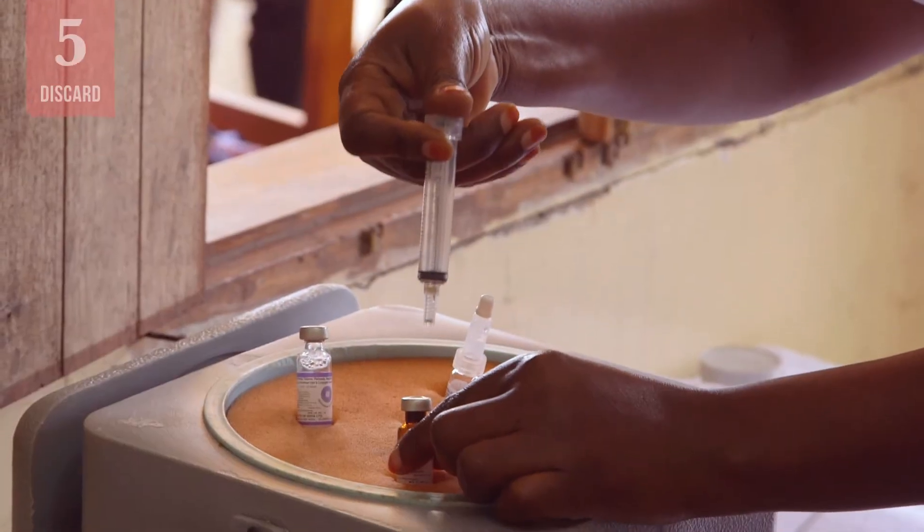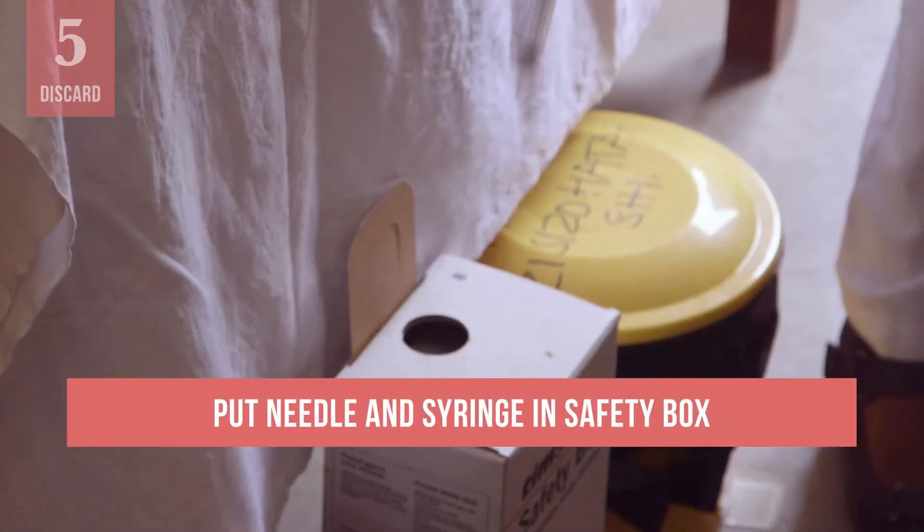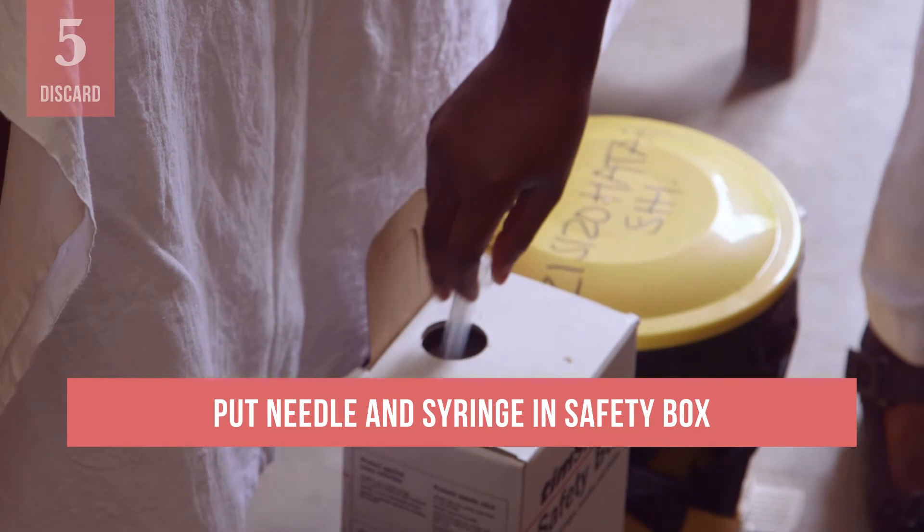Do not recap the needle after use. Dispose of the needle and syringe in a safety box, which is a leak-proof, puncture-resistant container for sharps waste. Be careful — many health workers are injured by accidental needle sticks after the injection but before the syringe is placed in a safety box.